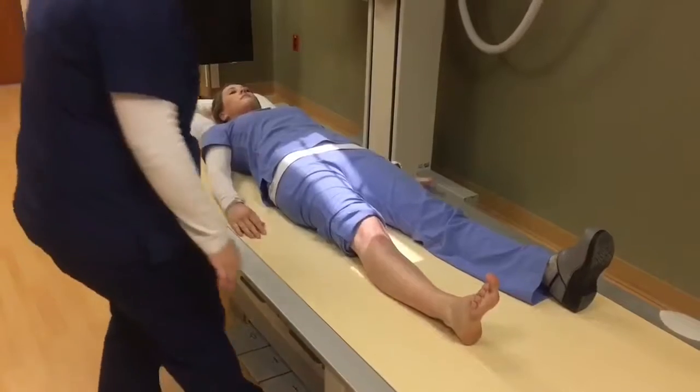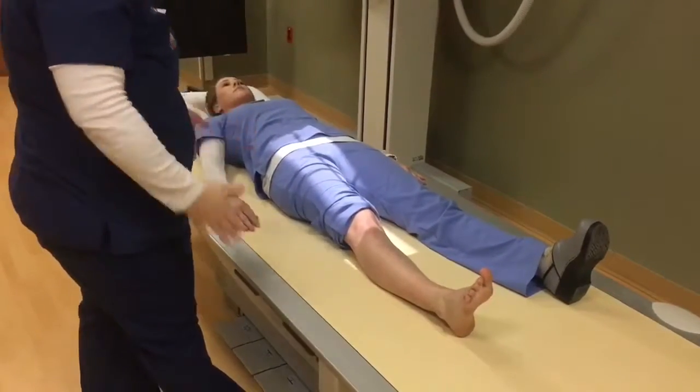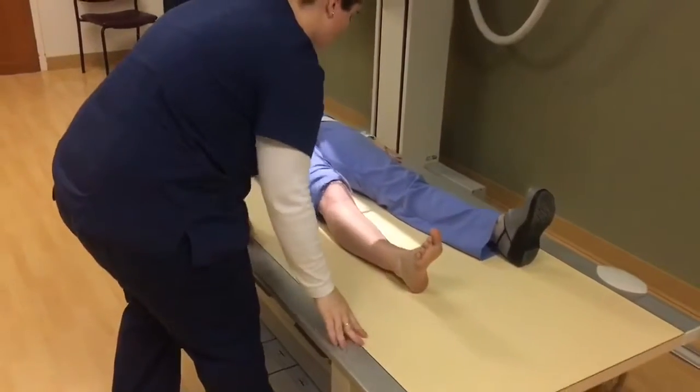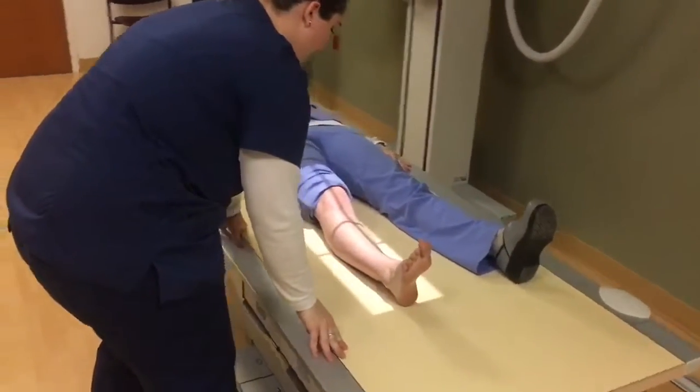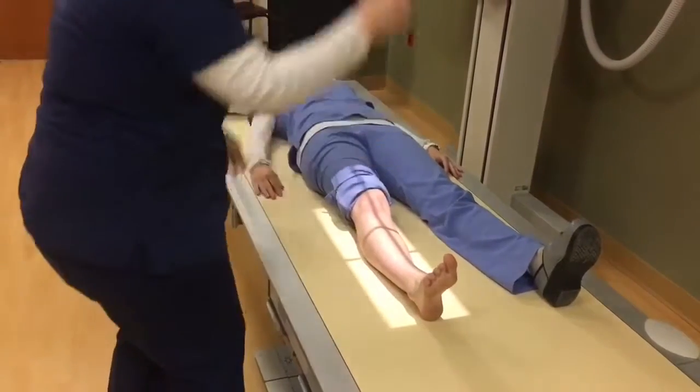Now I'm going to position my part. I don't want to touch the tube or the bucky since I already lined those up and detented them. I will move my table into the position I need. For the tib-fib, we want to include the ankle joint and the knee joint and adjust our light field as necessary.